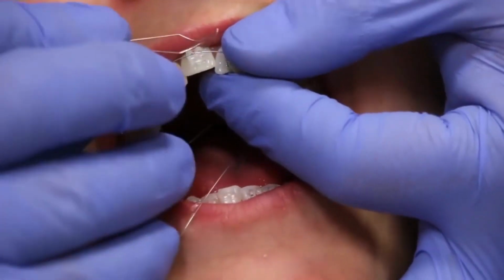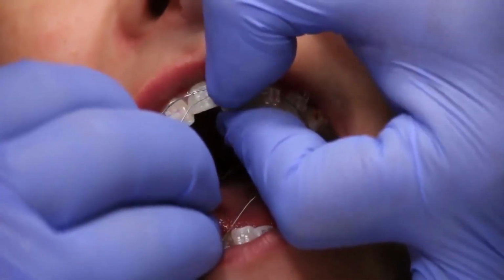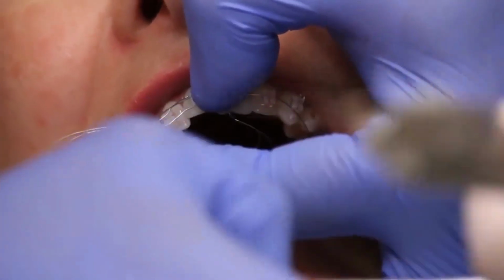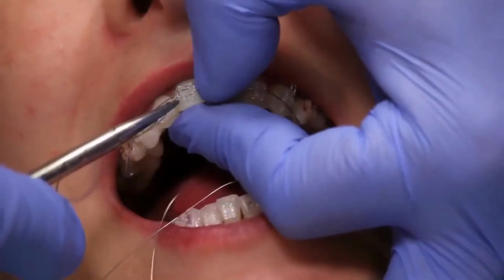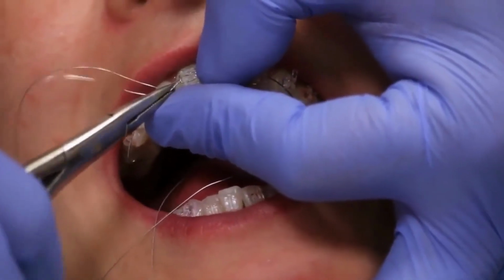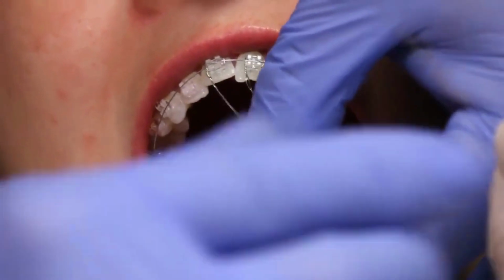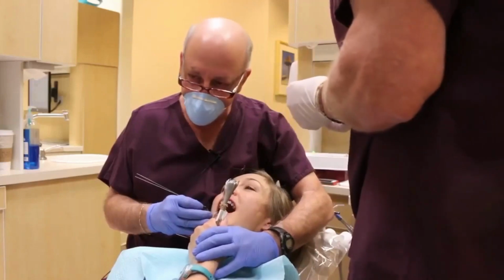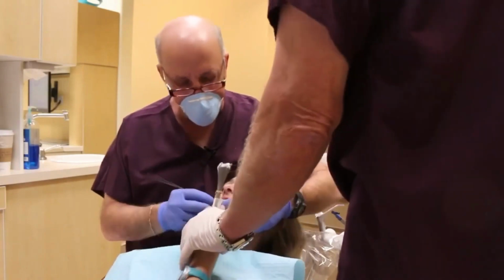Again, the assistant passed me the tie already pre-bent, and I just slide it over the tooth, twist my fingers, hold, and tie. If for any reason your assistant, which is actually the person that should be doing this, does not have an assistant, you can have your patient hold the ties for you, so your assistant can just grab the ties directly from the patient's hand.